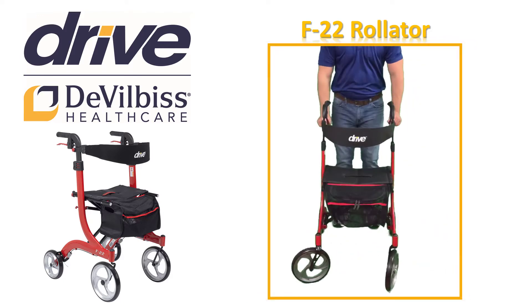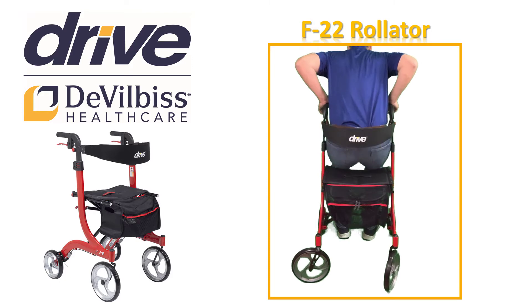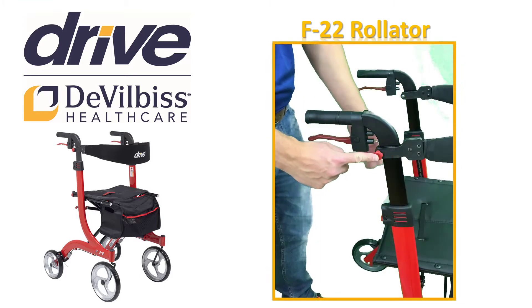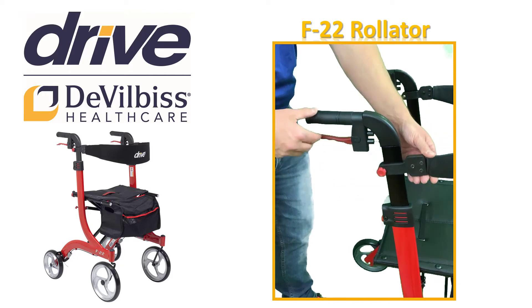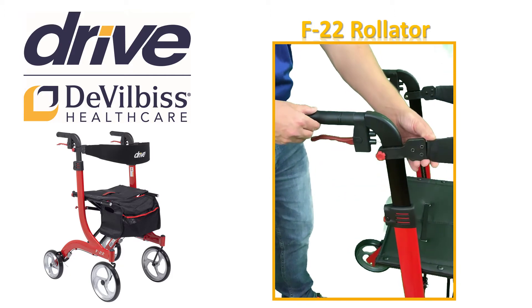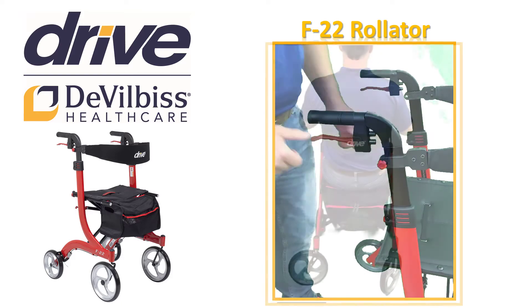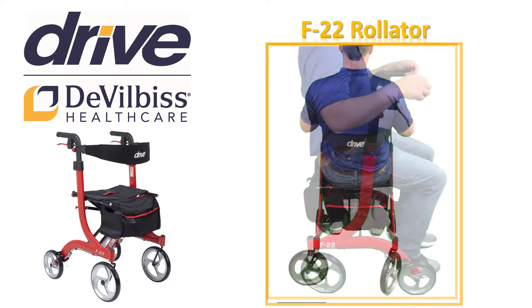Now on to the backrest adjustment, which is intended to support you while sitting on the seat of your F22. The backrest strap should support you in the middle of your back, about halfway between your waist and shoulder blades. Turn the knob counter-clockwise to loosen. Slide the backrest to the desired height, then turn the knob clockwise to tighten. Always sit with your back to the back strap. When sitting, never lean back. Sit with your back straight for your safety.